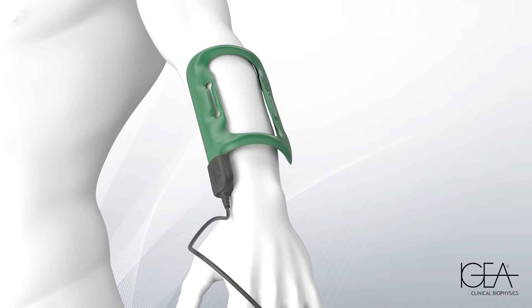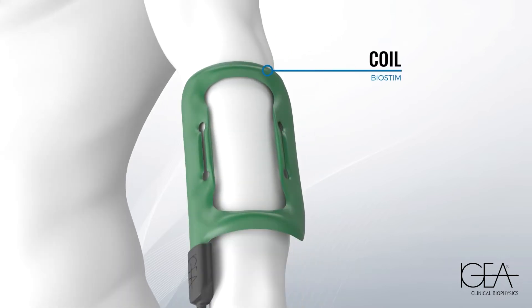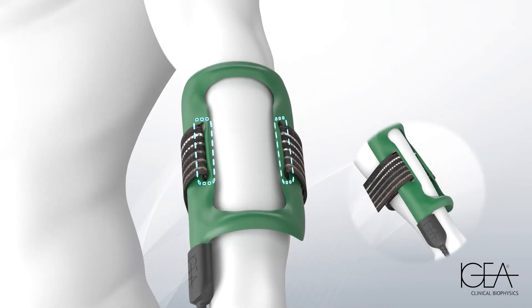Place the coil on the area to be treated, secure it with the supplied band without over-tightening, and then connect it to the generator.